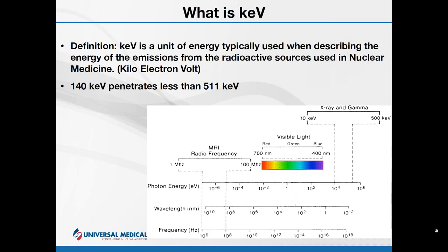In a later webinar, we're going to be discussing general gamma cameras and how they function, the concepts behind them, and we will be dealing with this issue when we talk about collimation and collimators, you know, the thickness of collimators and why different collimators have different thicknesses of septa, etc. But that will be in a later webinar.